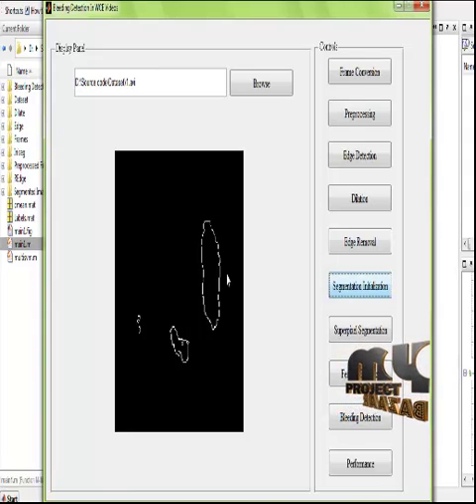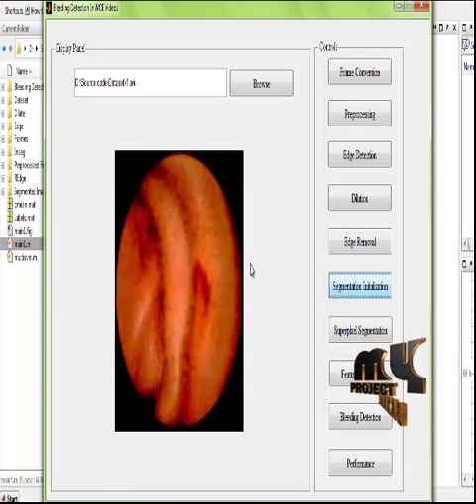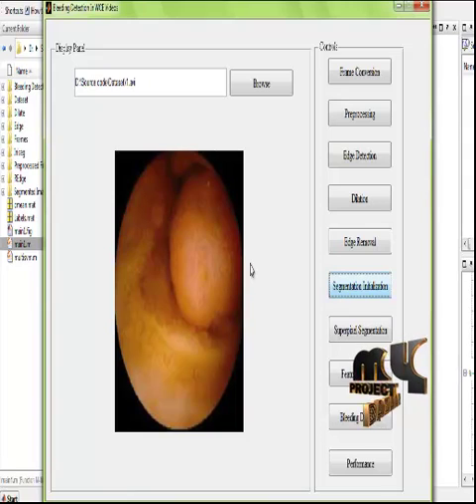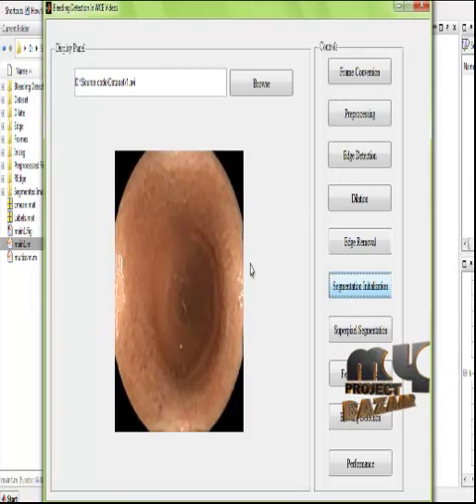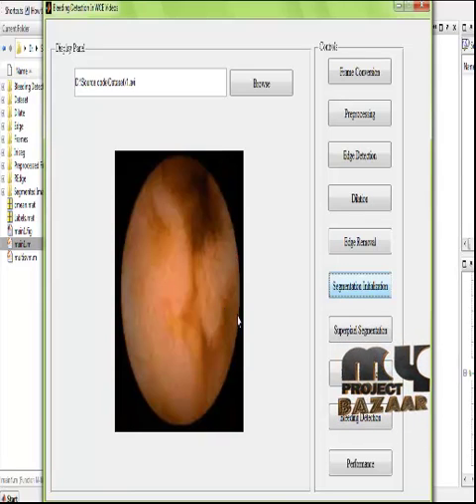Based on that, the regions in the images to be used for segmentation are initialized. Hence the regions to be searched in the overall video are reduced using this process. The white regions are matched and superimposed over the input video sequences, so that we can identify the needed portions in the video frames.